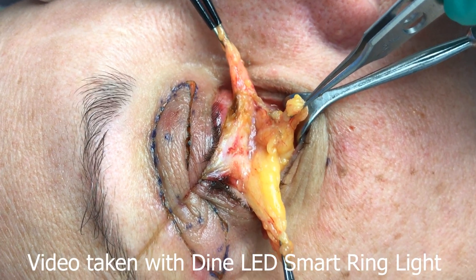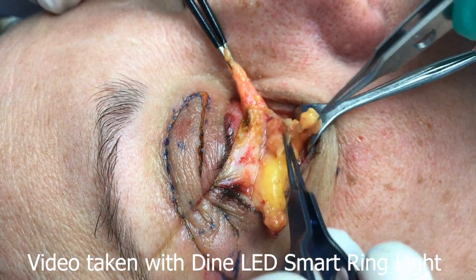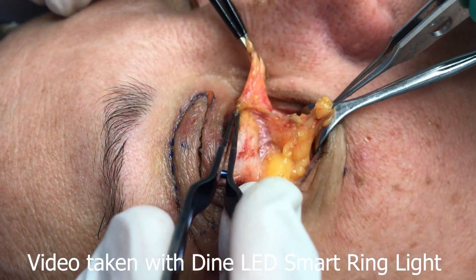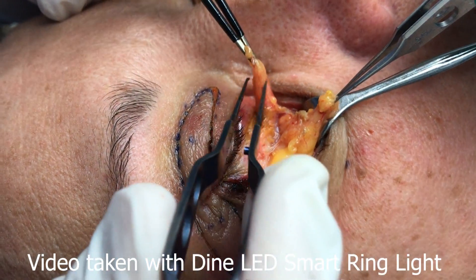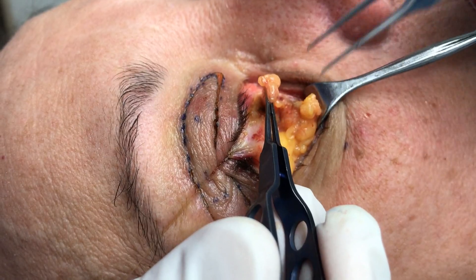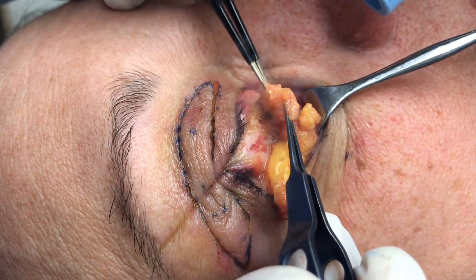Here are the three fat pads: the lateral, or temporal as it's called, the central, and then the medial, or nasal fat. What we're going to do now is get a bipolar forceps and start to reduce these fat pads.